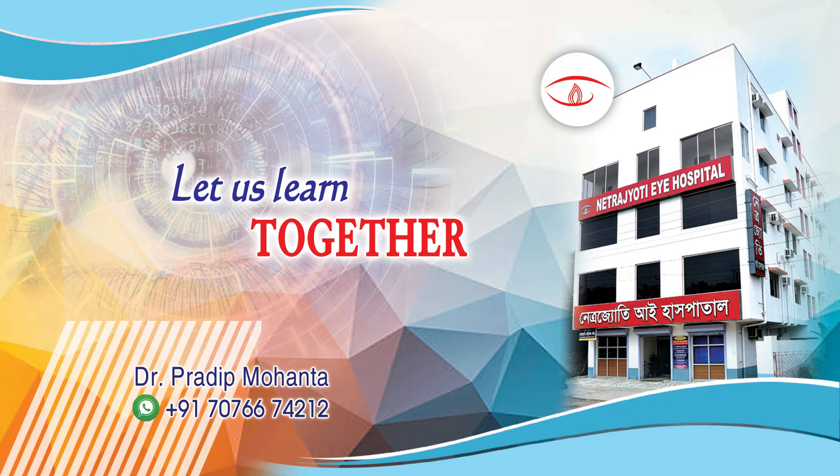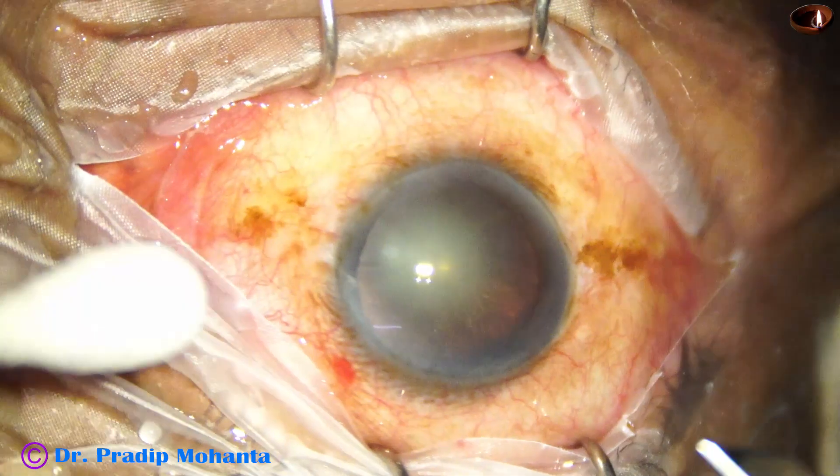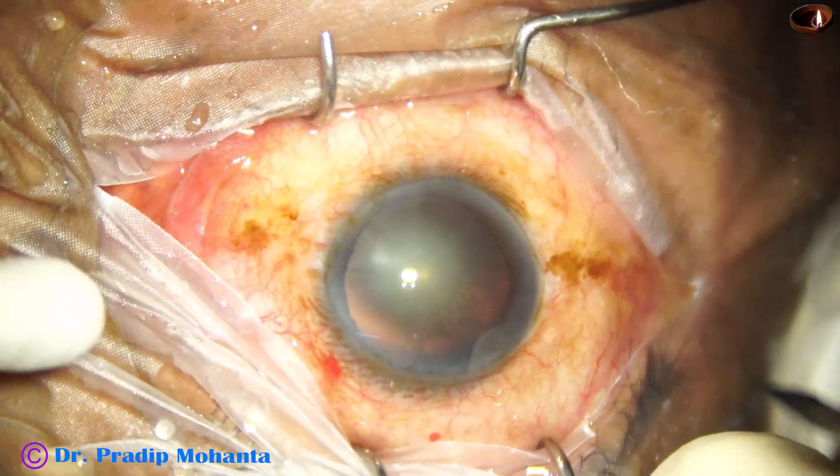Welcome to my workplace at Ranaghat, West Bengal, India. Let us observe management of this cataract with zonular dehiscence from 10 o'clock to 1 o'clock, that is three clock hours.